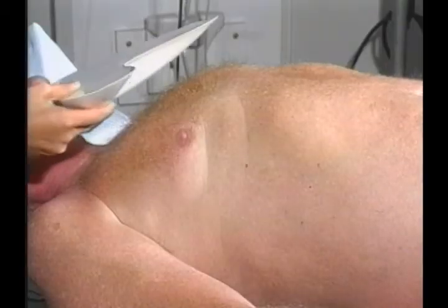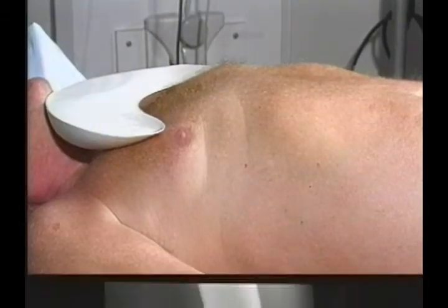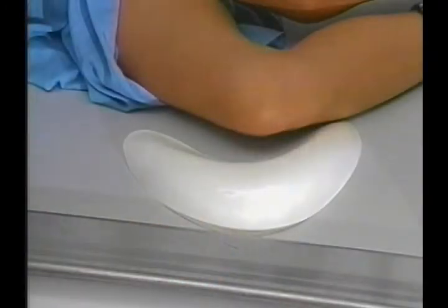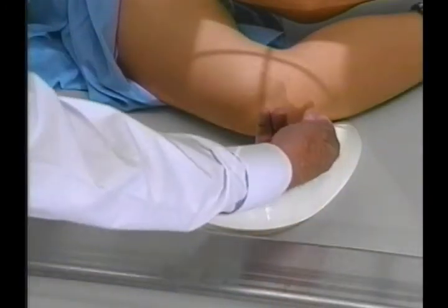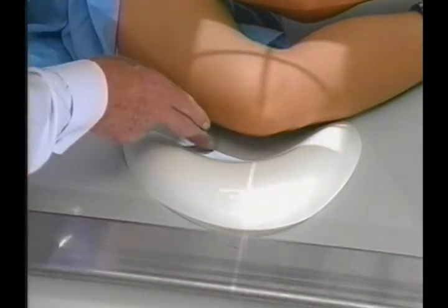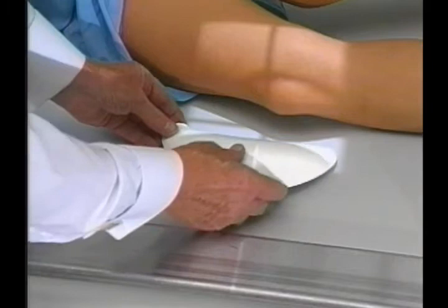You may protect C1 and C2, but only with patients with a preeminent lower thorax. Another application is the knee in profile with a slight flexion. One may protect the lower pole of the patella and the anterior tuberosity of the tibia, too often over-penetrated. The suprapatellar region must not be filtered, as this may simulate fluid in the joint.